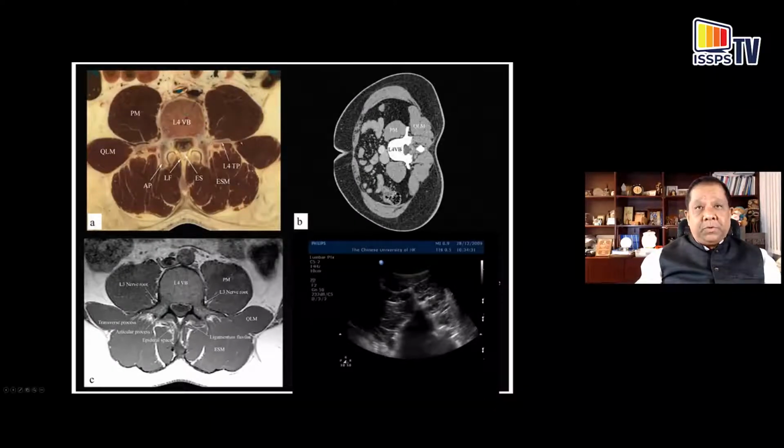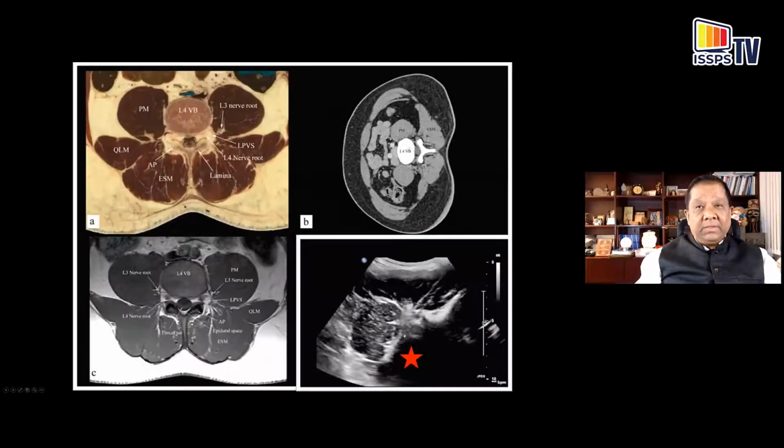However, at the transverse process level, as I alluded to before, you can also get the same image as seen to your bottom right, but the acoustic shadow of the transverse process obscures most of the anatomy that is relevant.